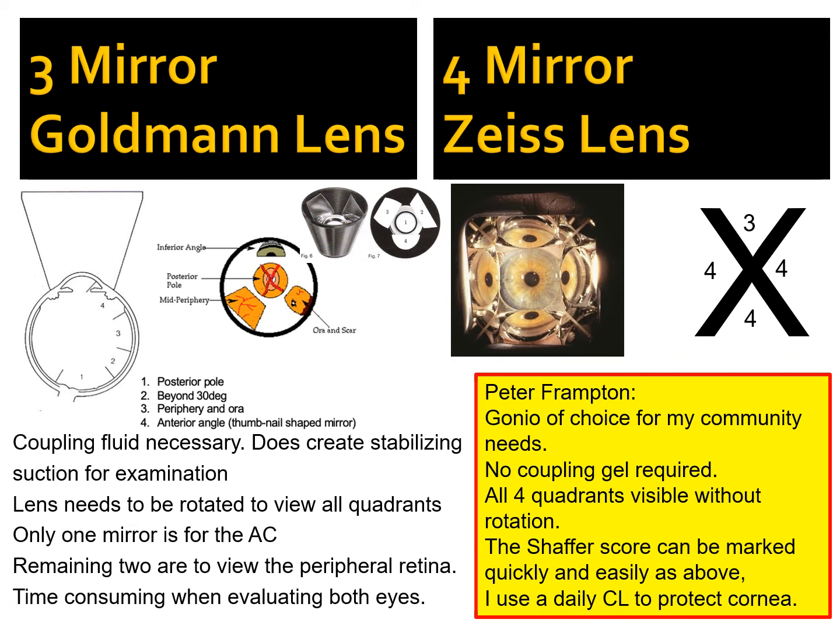Now, you have to have an awful lot of gonio lenses to go quarantining them, and I can't remember the exact amount of time, but you had to quarantine them for quite a long time. Because CJD being a protein, you can't just sterilize it, you can't kill it because it's already dead. And indeed, that's why I started using a daily contact lens to add extra protection when you're doing the technique, and it protects the cornea. And it works very well. To me, it doesn't muddle up the optics at all.